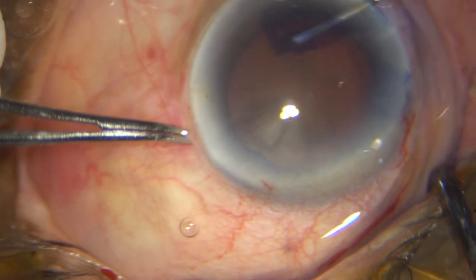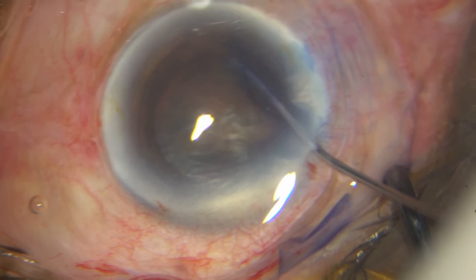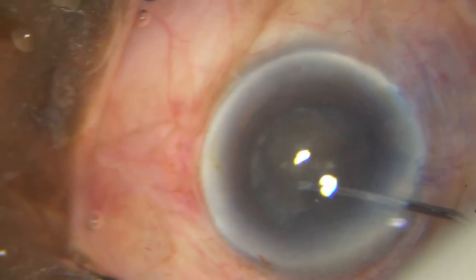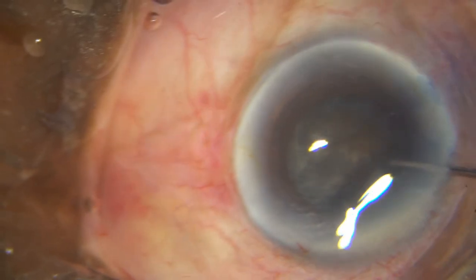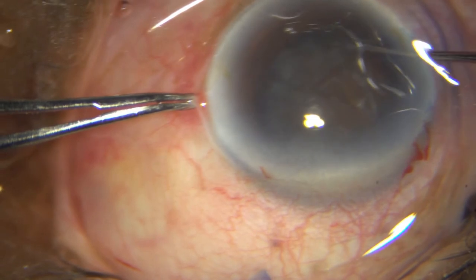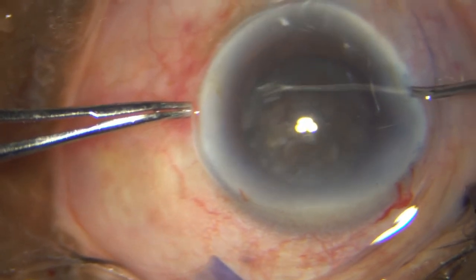Already the pupil is shutting down and I am not getting the plane to hydrodissect. Be very careful with your hydrodissection — don't have a misdirection. There, I can see the nucleus is lifting up, so it has hydrodissected. But these cases usually have a lot of capsulocortical adhesions, or they are so compacted that even with good hydrodissection it is difficult to rotate the nucleus, so sometimes you may have to use a little mechanical leverage.